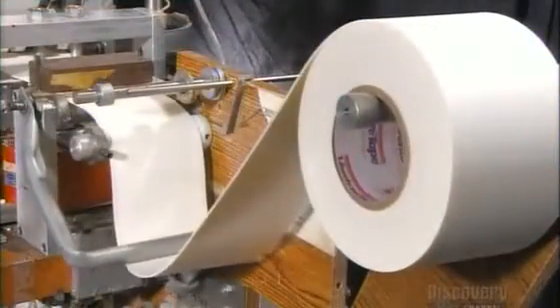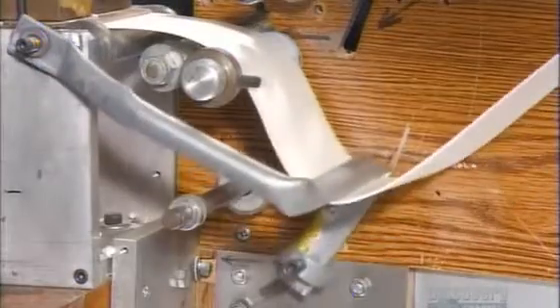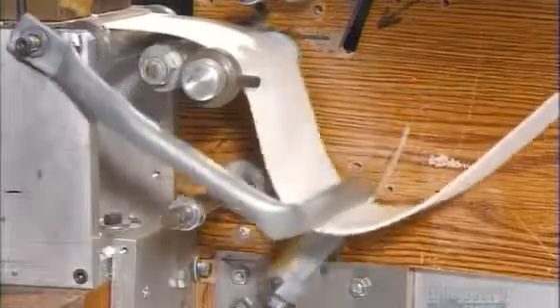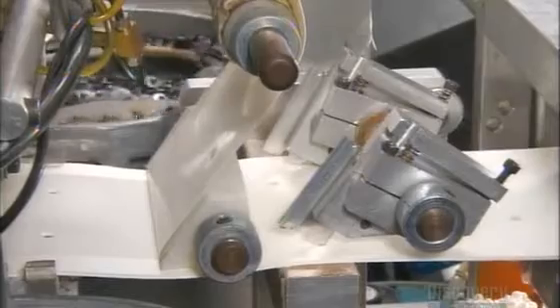These electrodes start with a roll of foam. The foam is coated with medical-grade adhesive and has a paper backing to keep the layers from sticking together. Machinery pulls the foam over a punch cutter, which makes small holes in it. Razors slit the paper, and equipment pulls it away from the foam to expose the adhesive. The process leaves strips of paper along the edge.